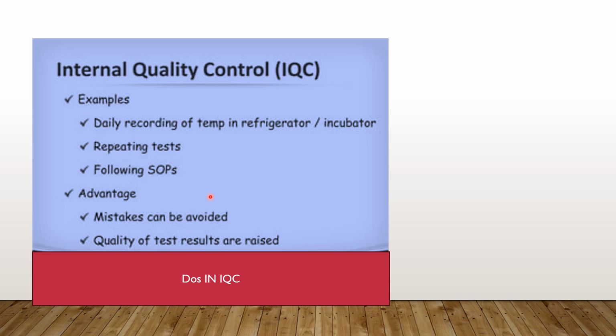So within the laboratory, we are going to start with all the equipment being nicely calibrated before we perform the test. Then daily control samples should be run first before the running of patient samples. Then a check for repeatability and the precision of the system, and the accuracy of the system result.